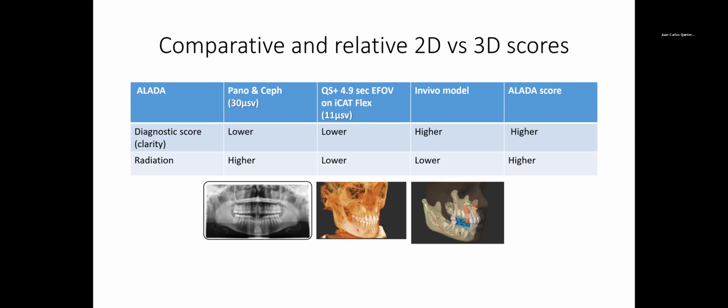What we're going to be talking about today, functional dynamic modeling, is interchangeable with many things. Invivo Model is the product name that Osteoid delivers for what we're going to be talking about today. Osteoid was previously known as Anatomodel, and the product used to be called Anatomodel. Now the company is Osteoid, the product is called Invivo Model. But there are different synonyms which may escape today. I may refer to Anatomodel, I'm still getting used to it. It's Invivo Model. It's also known as surface mapping or segmentation, and that will become clearer as we go.